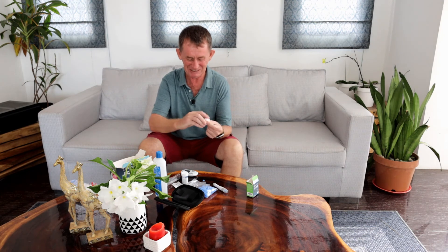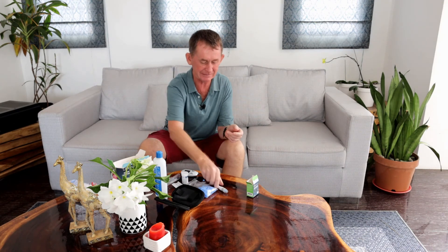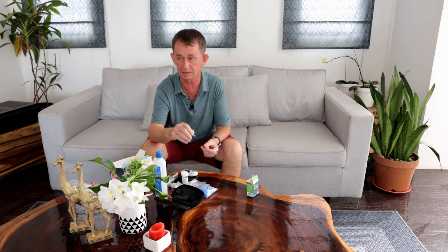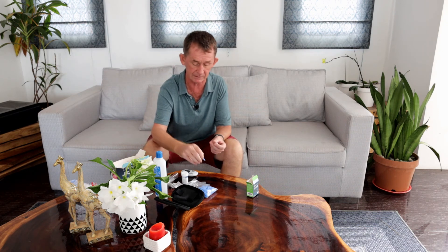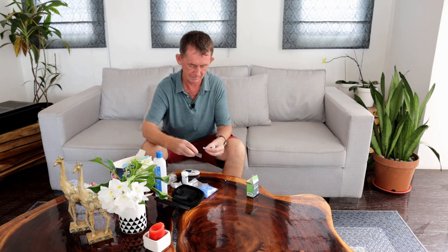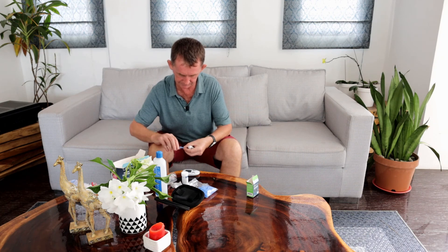I actually made too much blood. Now when you're finished, you must dispose of the lancet properly — this is a needle so it's supposed to go into a sharps container. The test strip also has to go into the appropriate disposal because of the blood. They have to be disposed of properly.